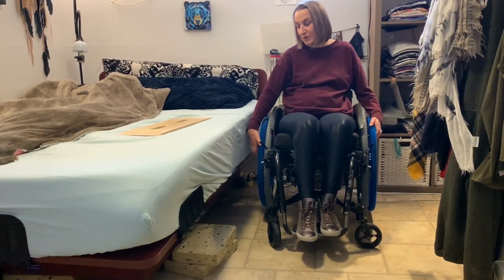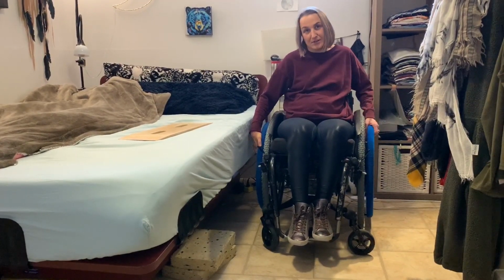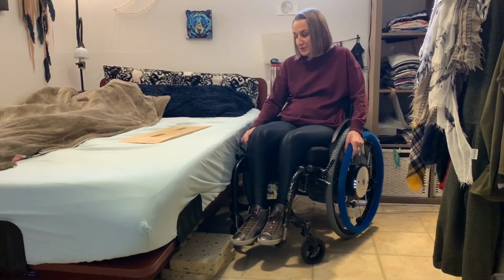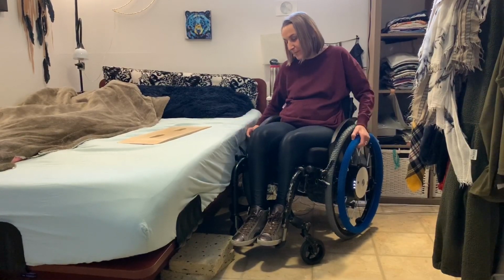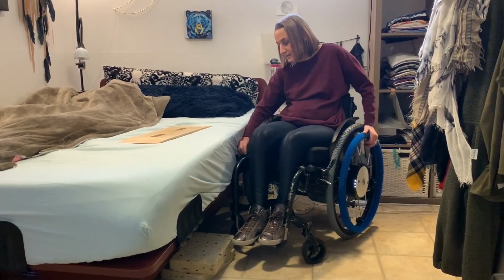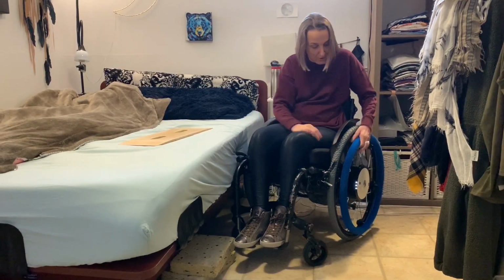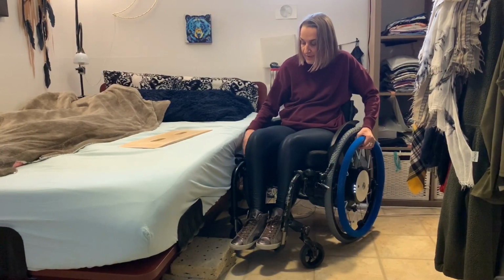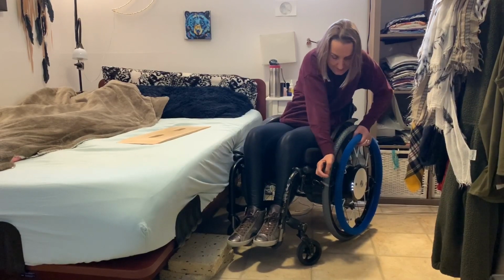So anyways, the key point at the beginning is to set up your chair so that you have the least amount of space between the chair and the bed. I normally put it at an angle like this, then set the brake that's closest to the bed first, push the wheel as close as I can to be tight to the bed, and then put the brake on the other side.